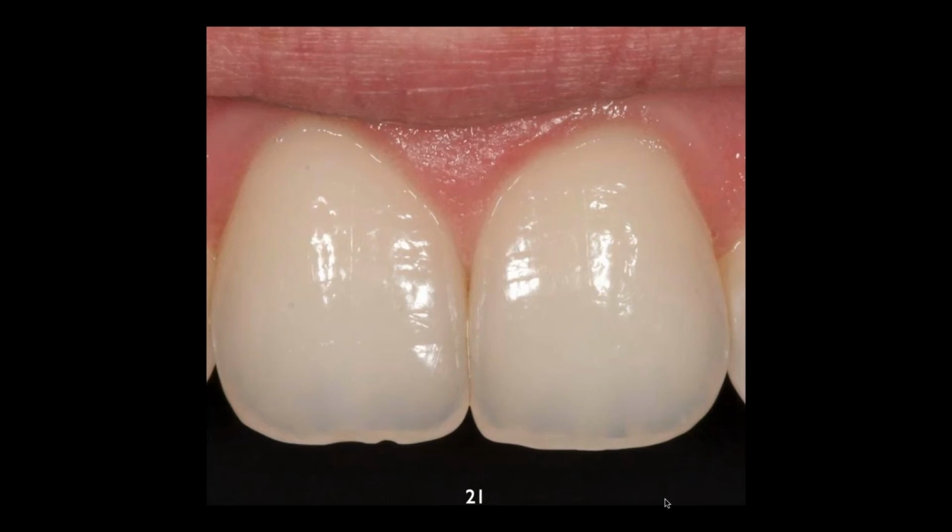And with that said, you have to ask, is my porcelain going to chip if I put it on the incisal area? Well, if you slow cool it and you design your framework right, that really is minimal. They've changed a lot from fast cooling big arches and really piling the stuff on. You have to have support for some of the porcelain, but you also have to be lenient enough so that you can have some aesthetic results.